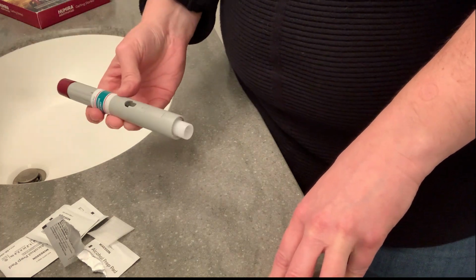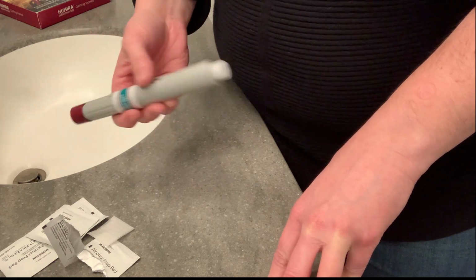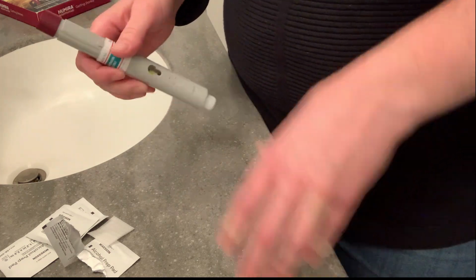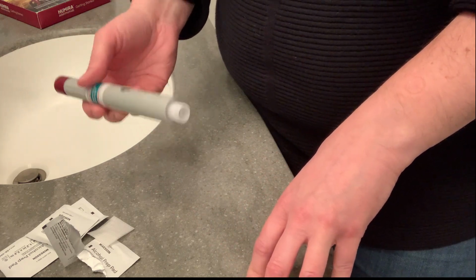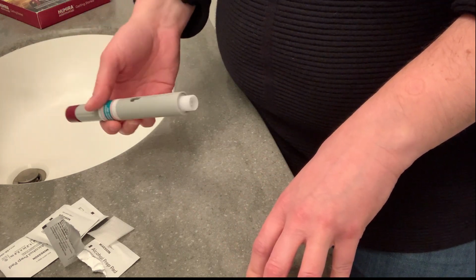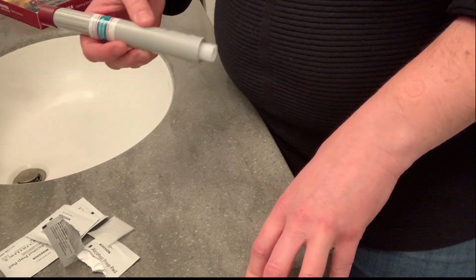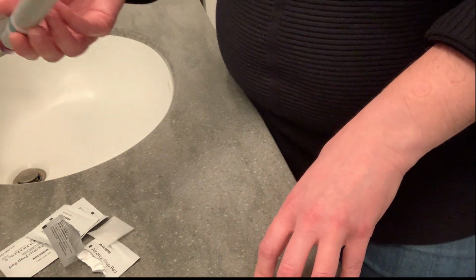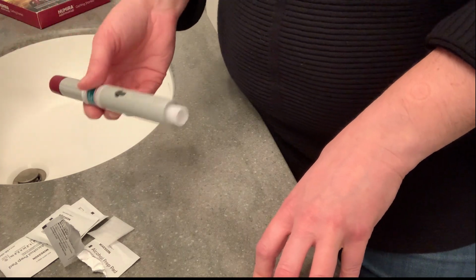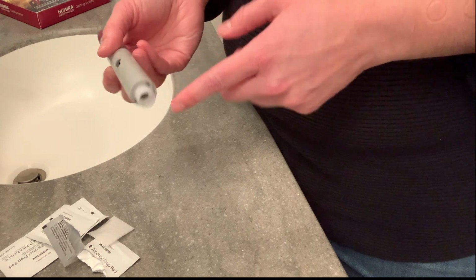If you don't have one, you can use an old can of coffee or something like that. And then once everything is full, you'll have to bring it to a sharps disposal center. But there are some programs that you can sign up to online, where you basically mail it to a company that basically disposes it for you. Don't put it in the garbage. You know, it is a sharp.